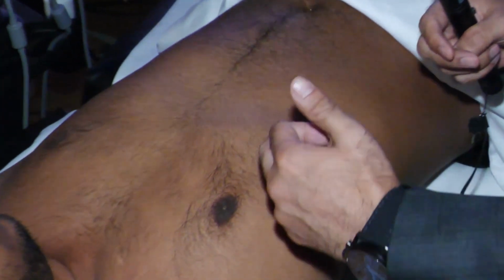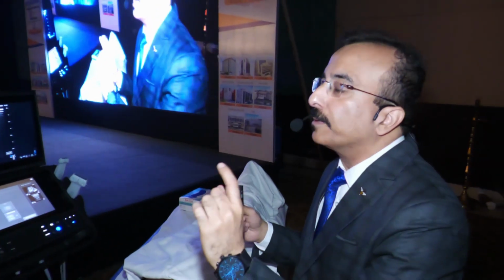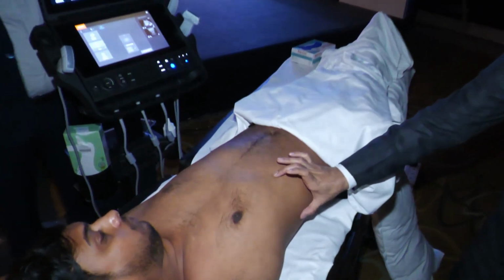Oblique from the mid-clavicular line to the anterior axillary line so that the drug spreads both ways. Please look at my hands, so that it catches the anterior cutaneous branches as well as the lateral cutaneous branches. The biggest problem with the subcostal tap is that it is not catching the lateral cutaneous branches. That means from the mid-clavicular line till anterior axillary line consistently.